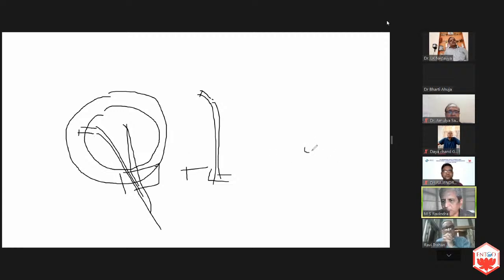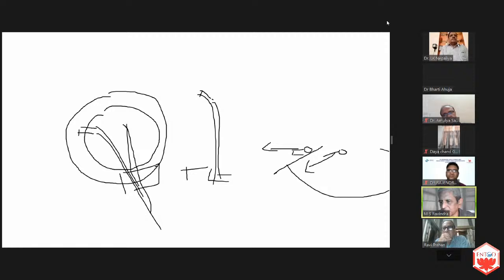What I mean to say is, end on, it is like that. I rotate it axially so that it goes in the direction now. Instead of facing laterally, now it is facing downwards, and that is the lens there. It goes downwards while axially rotating it downwards. So I'll have a beautiful hydrodissection.